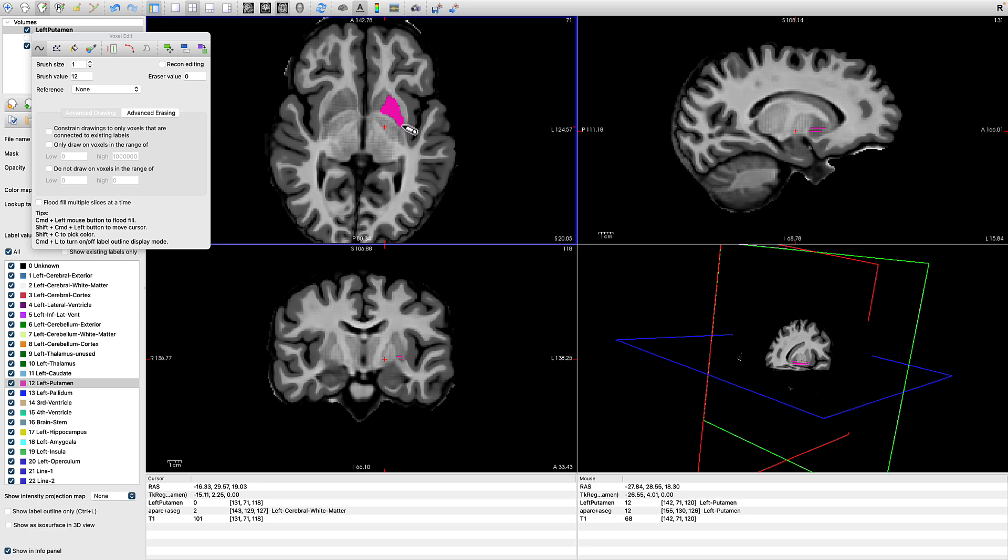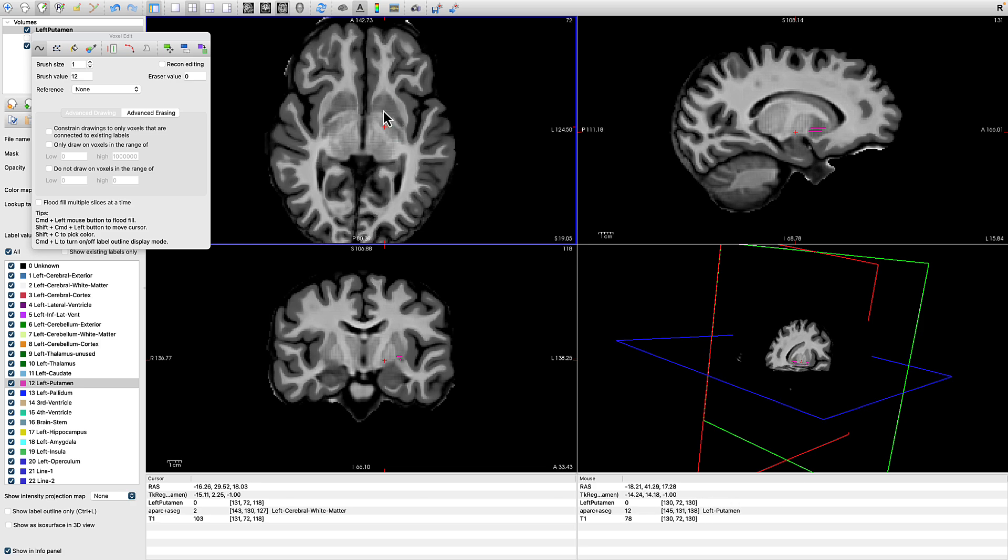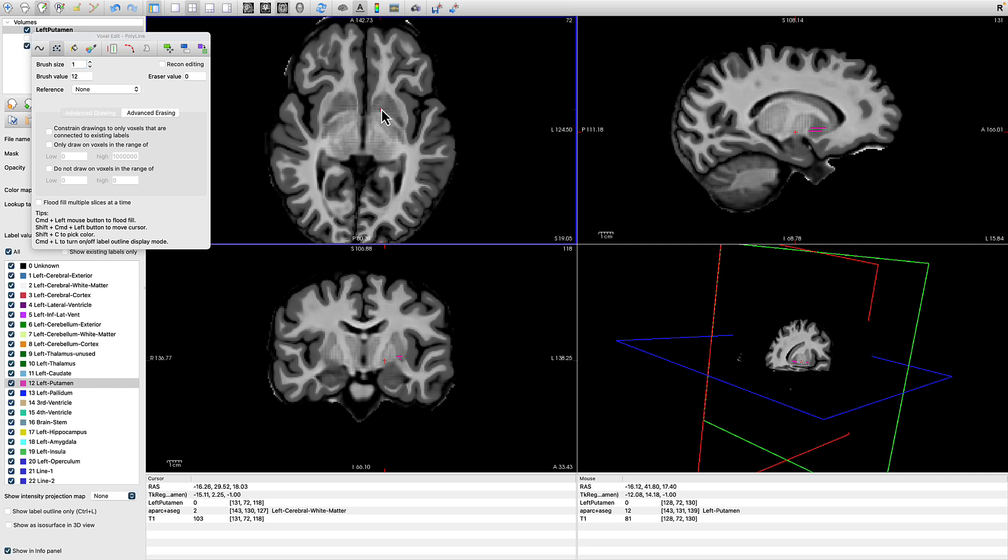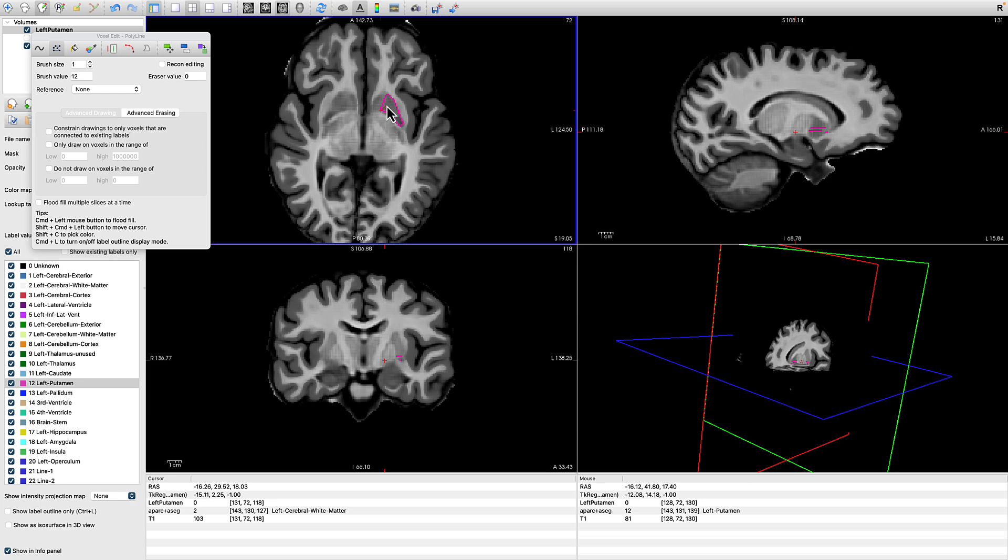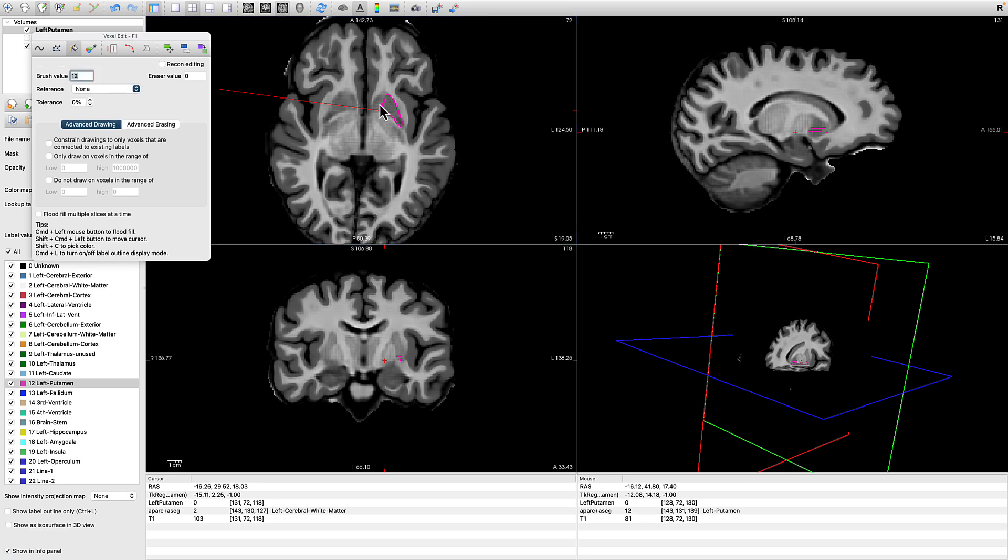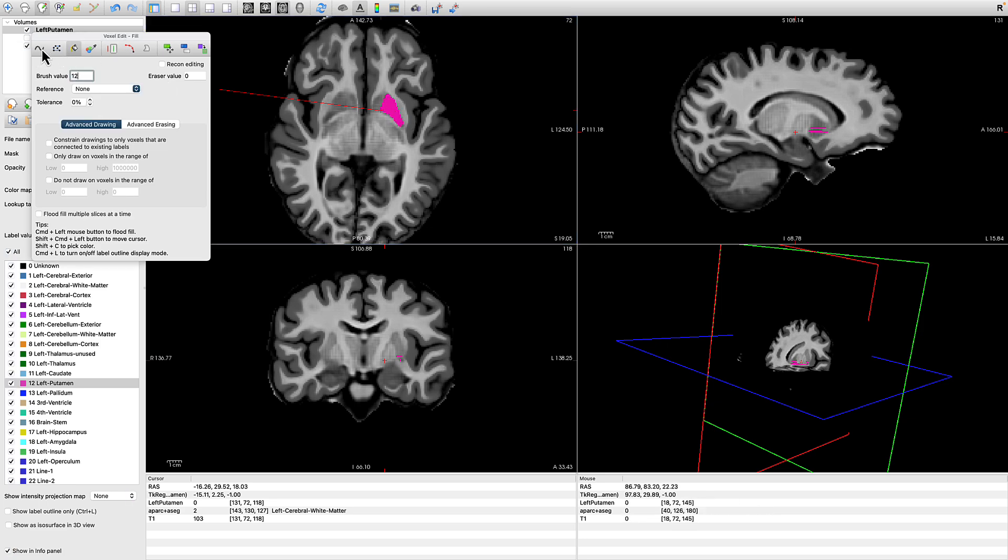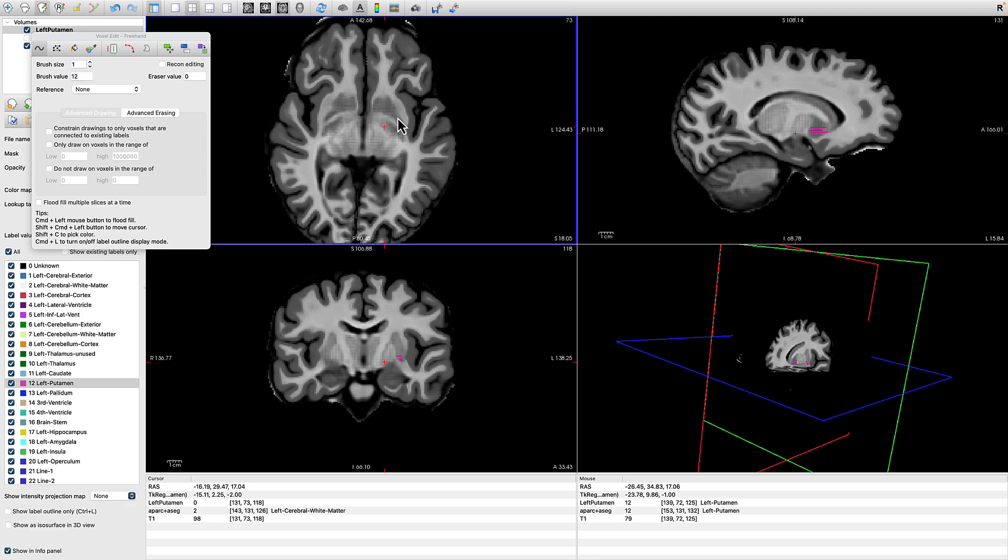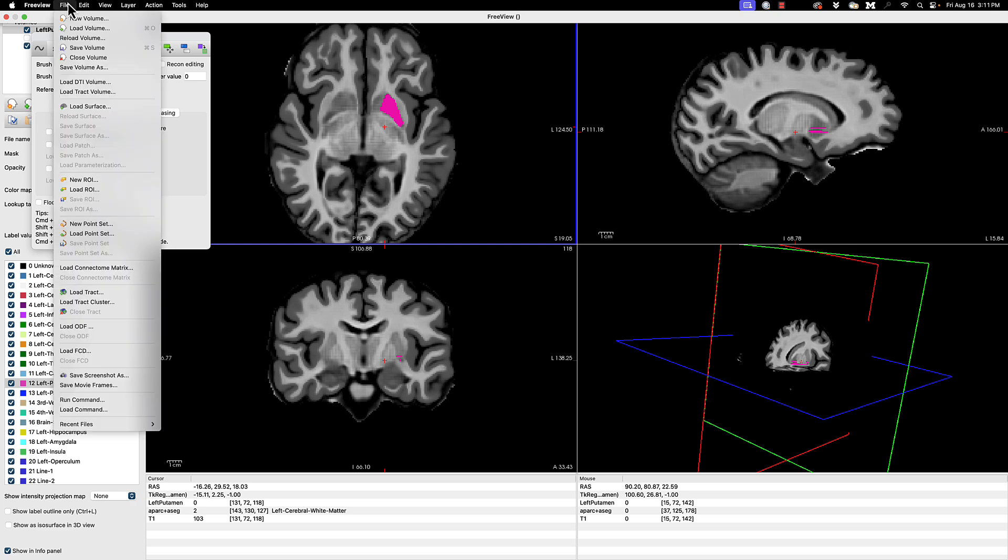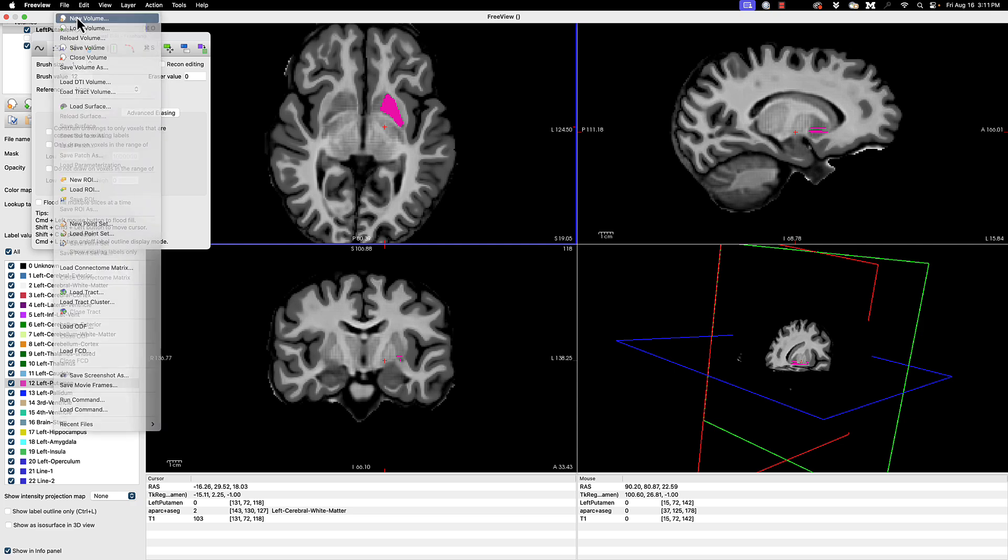Refill the ones that I just deleted in here. You can also use something called a polygonal line tool to mark out with individual left clicks, the boundary of the structure you want to fill in. So I'm going to do that roughly where the putamen is and then select the bucket tool and left click in the boundaries to then fill it in. So those are a few options, different ways to use the voxel edit tool to create a new region of interest.